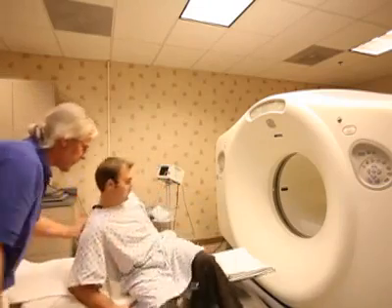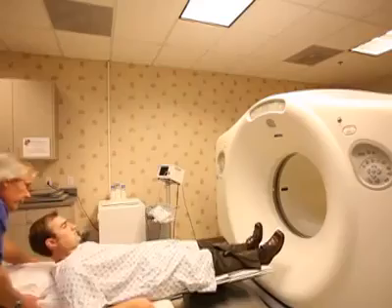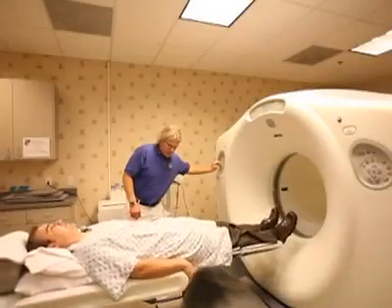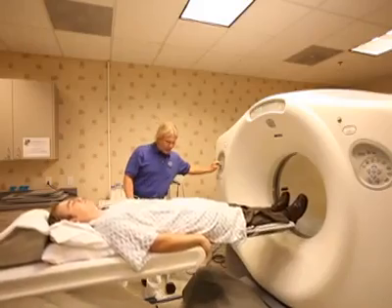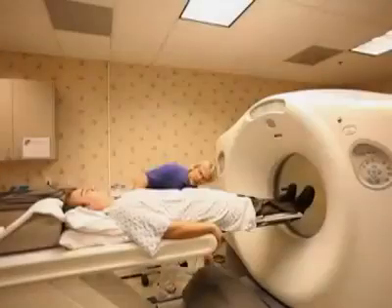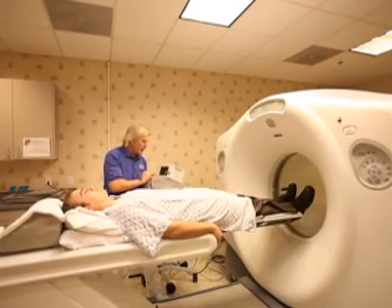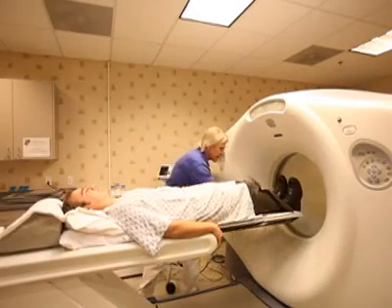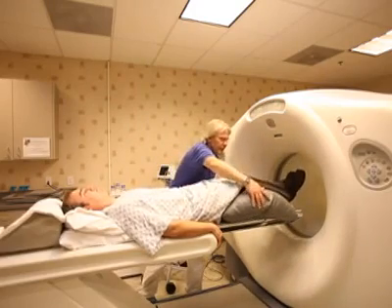First, we ask you to lie flat on the table. We then raise the table so that your legs will be able to move freely into the scanner. By placing a cushion under your legs, thereby straightening your back, we make lying on the table more comfortable.